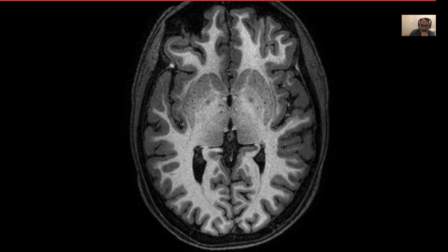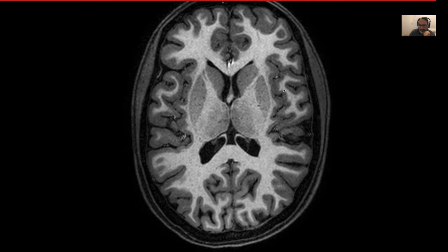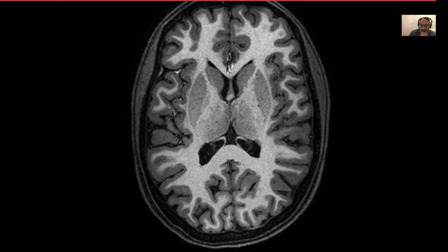Now, let's just keep looking at the lobes. So that was still the frontal lobe. That's the occipital lobe. Now we're back at the level of the putamen, globus pallidus, thalamus. There's another thing that I want to show you here, that you'll see a long fissure here, and also on the other side, but it'll show up a bit. Yeah, there you go. There you see it on the other side. And this is the Sylvian fissure. So the Sylvian fissure is what divides the frontal lobe from the temporal lobe. So as soon as you see the Sylvian fissure, you're going to start seeing the temporal lobe on this side.